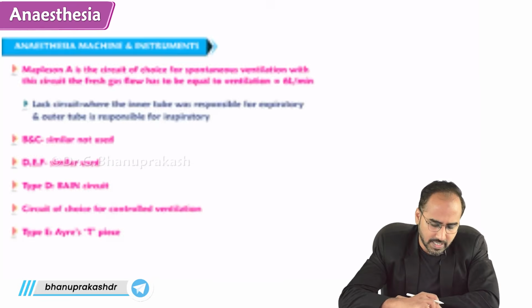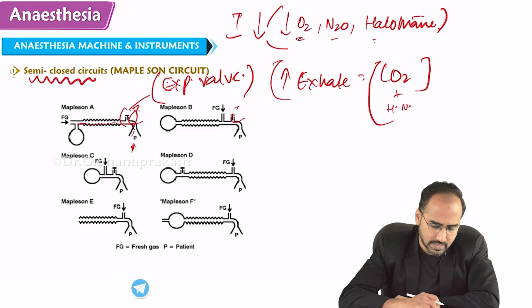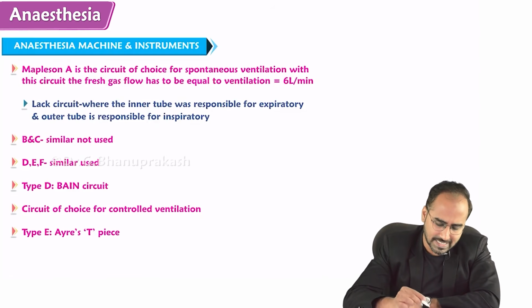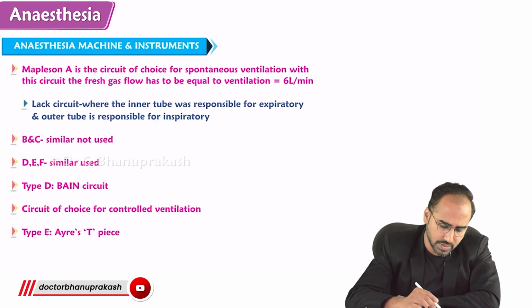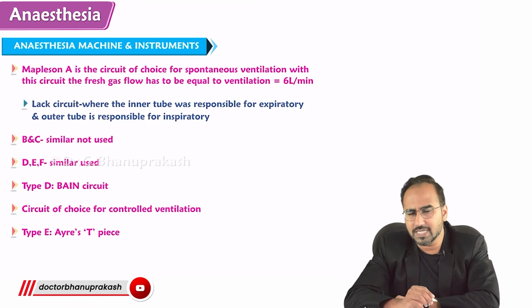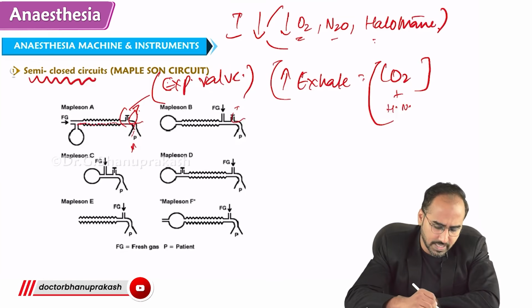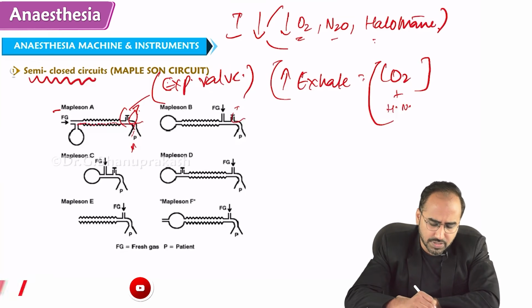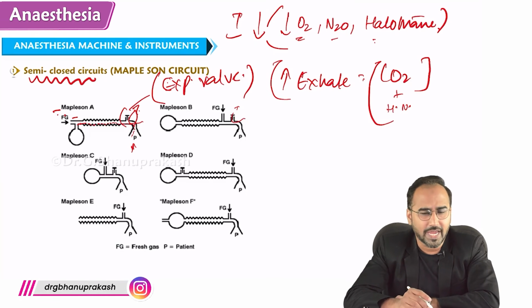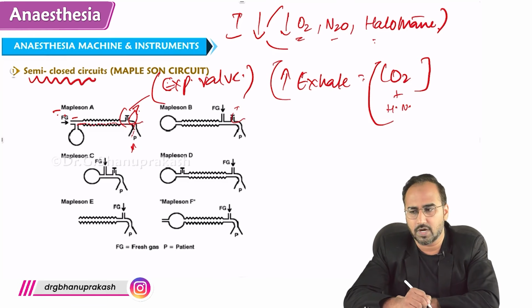So anyways guys, we are talking about the anesthesia circuits, semi-closed and closed breathing circuits. In semi-closed, they are Mapleson. Remember guys, all these semi-closed circuits were introduced by a guy called Mapleson. Hence, all these circuits are called Mapleson circuits.